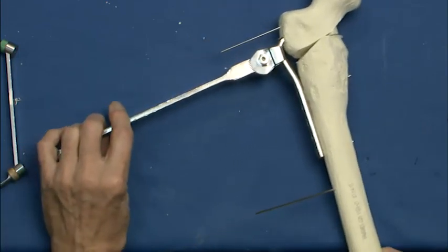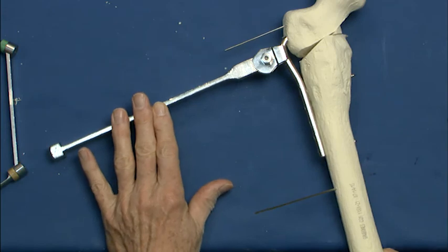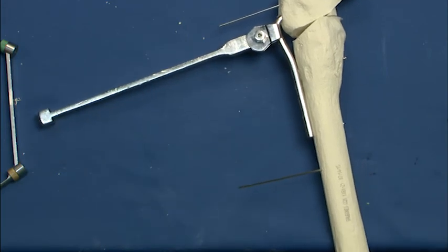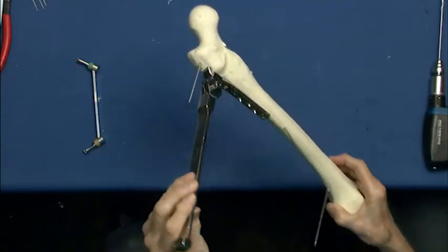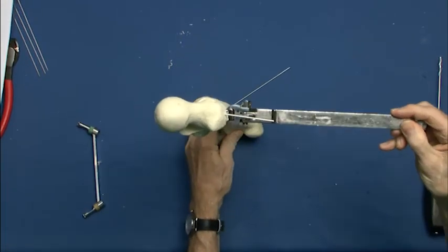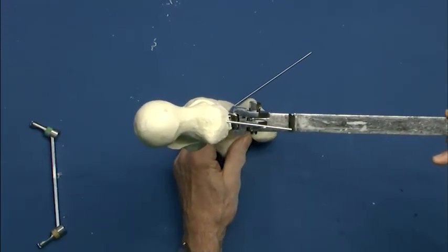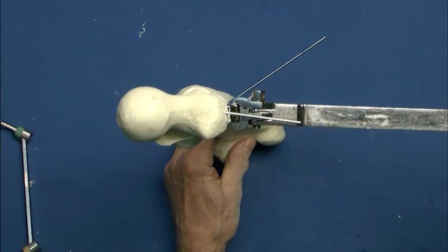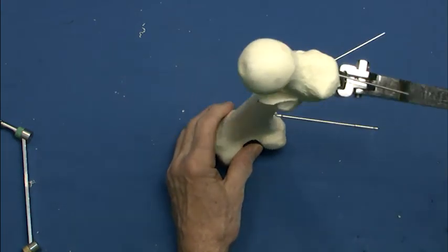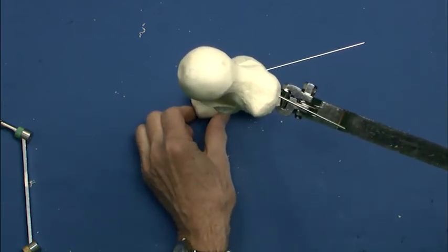I've left the insertion handle on because this was our reference with our distal drill bit for the horizontal plane, which we've already checked. So if we check our horizontal plane here, we can see that at the end, we have a seating chisel handle, which became a blade plate handle. And now those are parallel, and we now have a restored femoral anteversion of about 15 degrees.